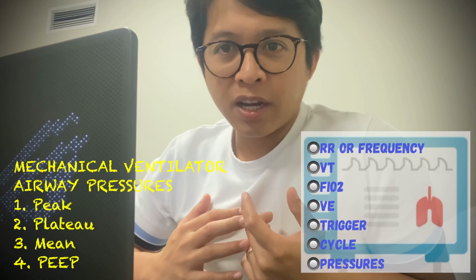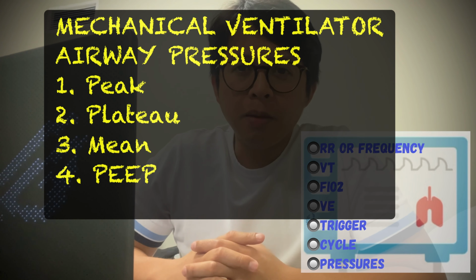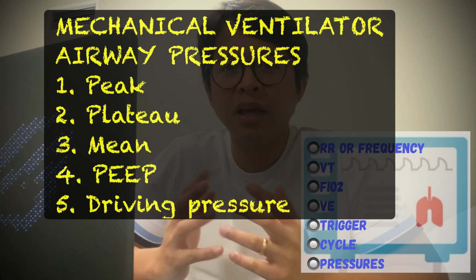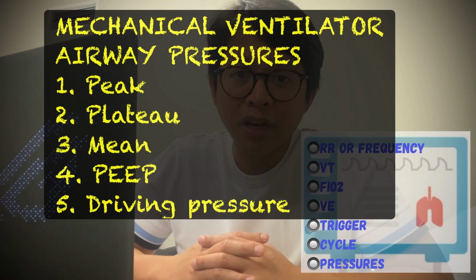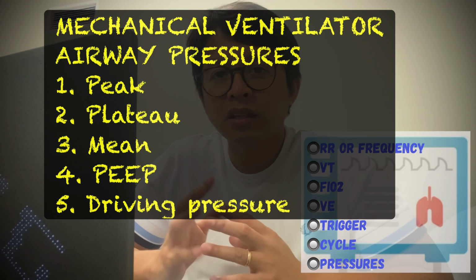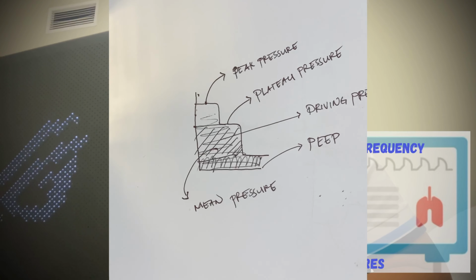Wait. I almost forgot. I need to mention this because it's worth mentioning. In the management of ARDS, routine application of driving pressure is under study and may help in decreasing mortality and improving the management of acute respiratory distress syndrome, or ARDS. Driving pressure is the plateau pressure minus PEEP. It can also be expressed as the ratio of the tidal volume to respiratory system compliance. So the difference in this area is your driving pressure, this area here. Okay? That's the end of our topic.